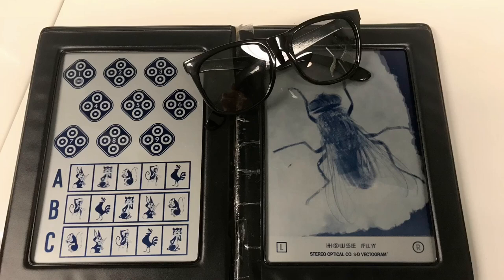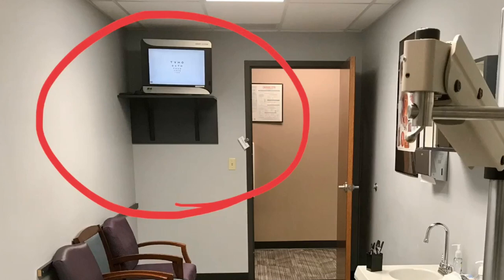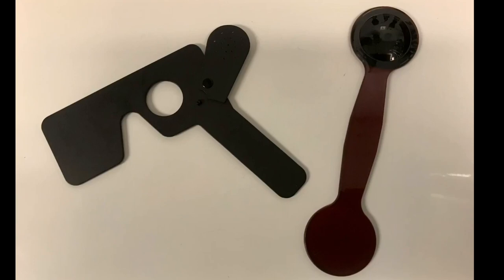Measuring stereopsis should be the very first examination element performed. This is because occlusion will disrupt fusion. When testing visual acuity, the chart chosen must be calibrated to the length of your examination room. While Snellen optotypes are ideal, the optotypes used must be age appropriate. Occlusion with an adhesive patch is preferred over using a handheld occluder, a bare hand, or a paddle-type occluder. All of these can be cheated with.